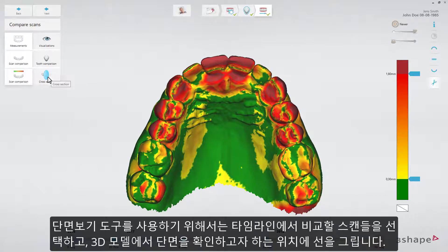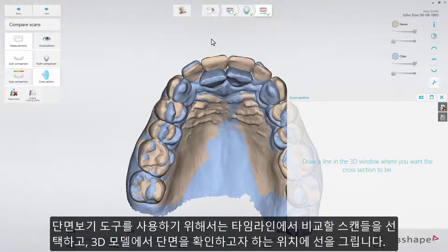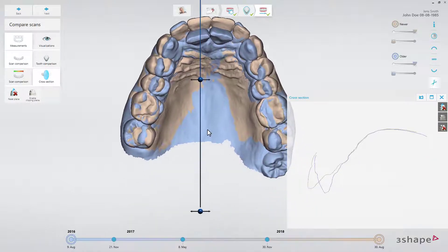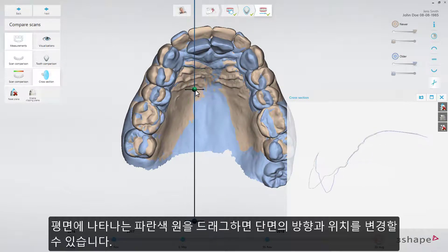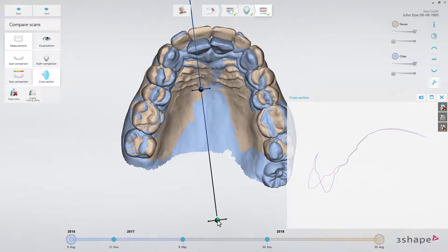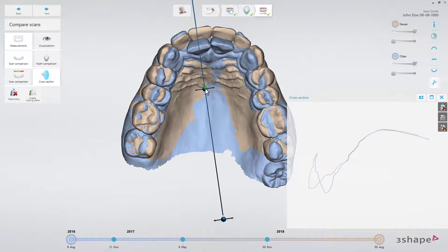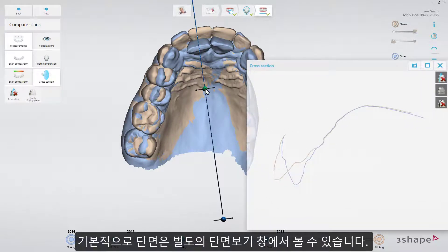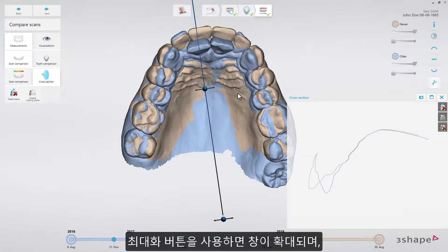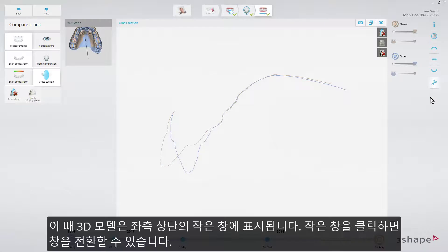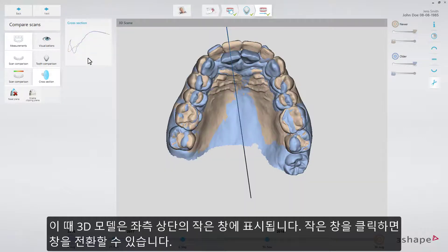To use the Cross-Section Tool, select the scans you want to compare on the timeline, and then draw a line on the 3D model where you want the cross-sectional view. You can adjust the cross-section's orientation and position by dragging the blue dots that appear on the plane. The resulting cross-section appears by default on the cross-section sub-window, which can be enlarged using the Maximize button. In this view, the 3D scene now appears in a small window in the upper left corner.